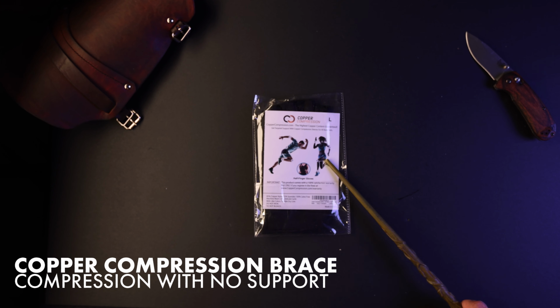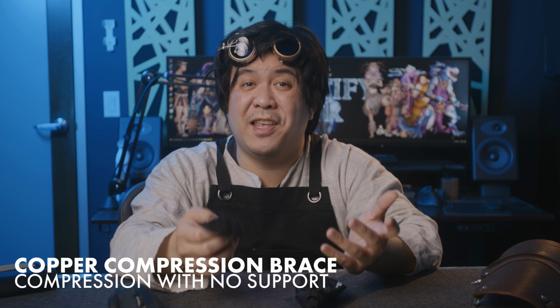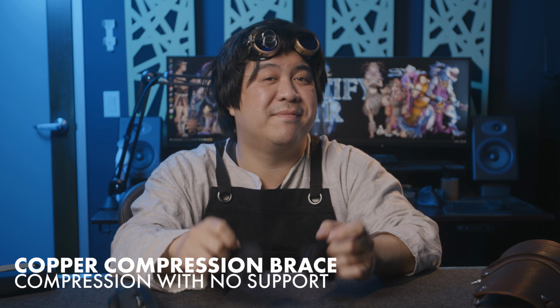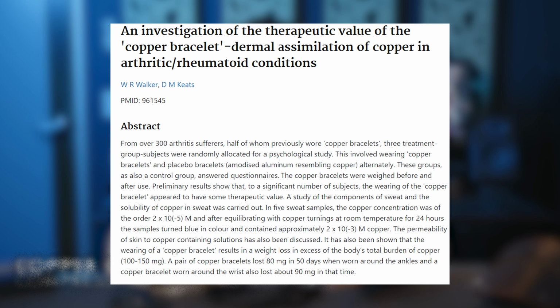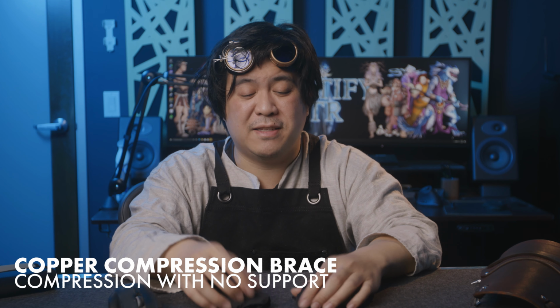The second compressive brace is something called the copper compression brace. I wasn't gonna include it, but I figured that I should talk a little bit about the magical claims that they make about this product. So there is some weak research that I really wouldn't even call research that suggests that copper can have some curative properties in terms of muscular pain relief, but there's really nothing convincing. I don't think that the evidence supports it at all.